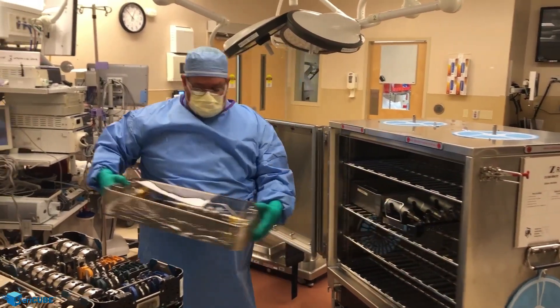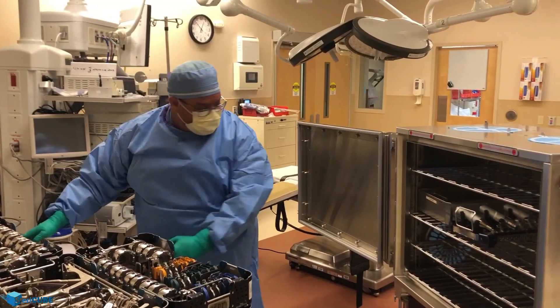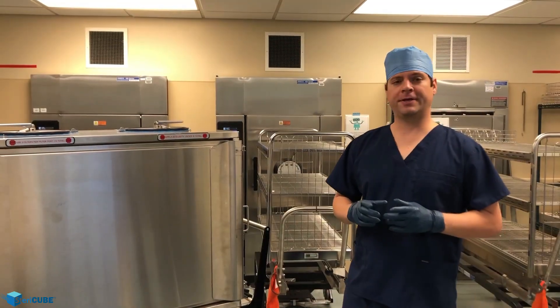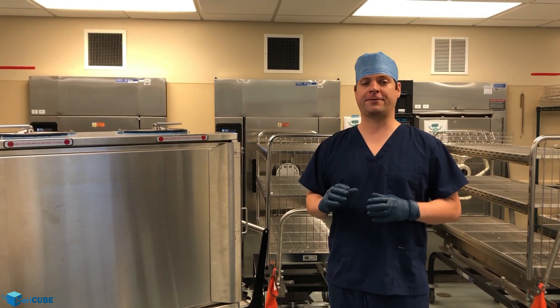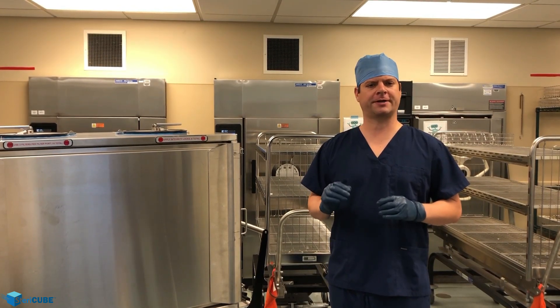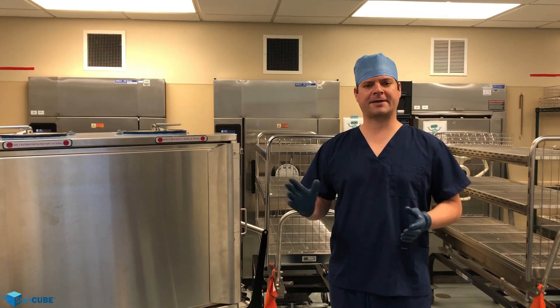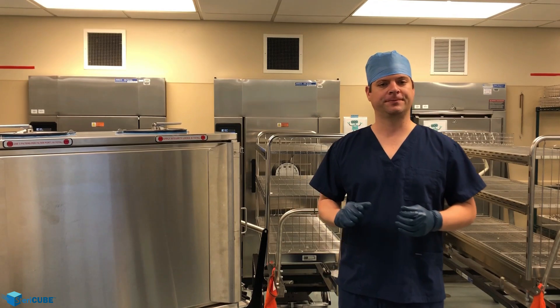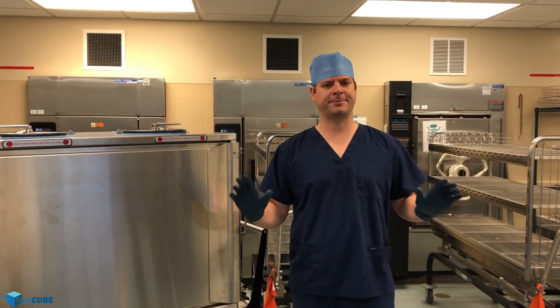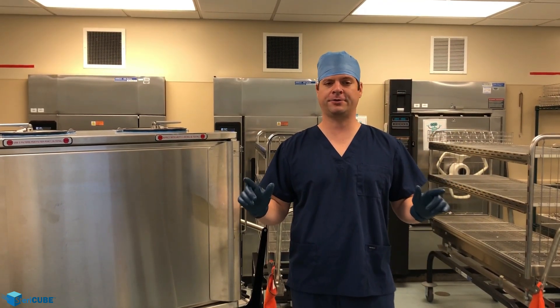Scrub techs can see and access every tray, each at an ergonomic height. The unique advanced capabilities that the Stericube offers allow surgical services and sterile processing departments the flexibility to reimagine their service design and delivery. The advantages of mass customization for surgeons and procedures are now possible and feasible. Standardization across systems can be streamlined for kitting techniques and unitized delivery.